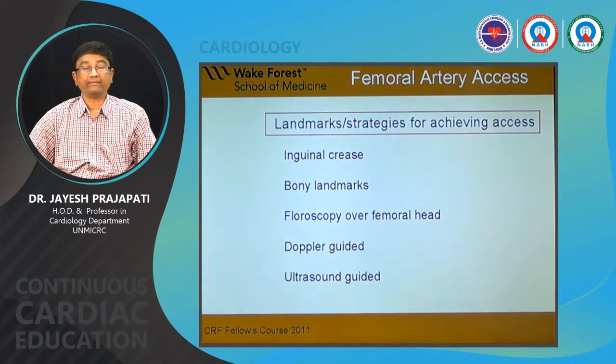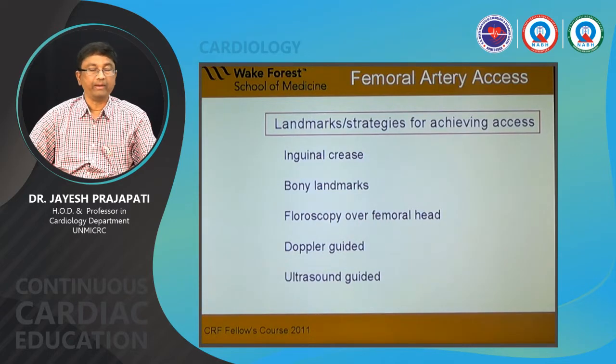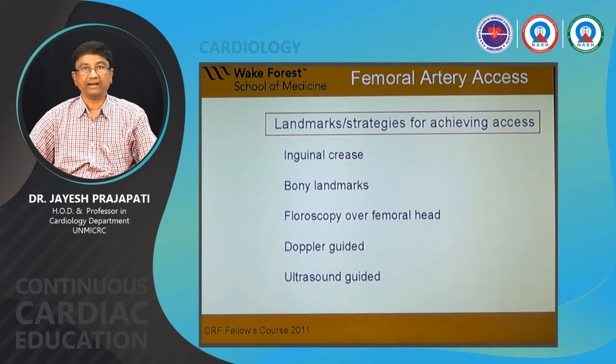So which are the bony landmarks? The inguinal crease is not the thing you go by. You always have to go with the inguinal ligament. Ligament and crease are different. If someone is obese, the crease will be different. So you have to palpate the ligament. The ligament is a very rod-like hard structure. Your puncture should be below the inguinal ligament, not above the inguinal ligament.